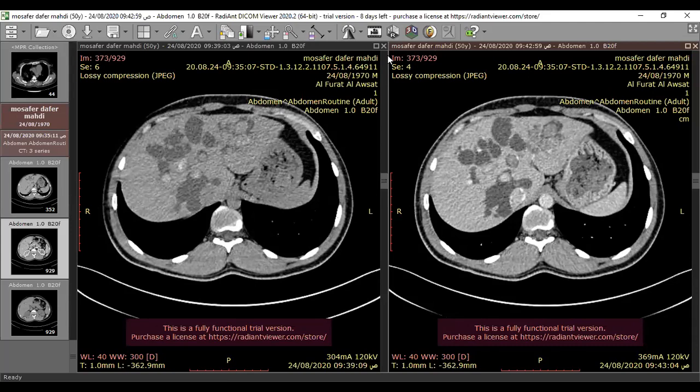Complications include cholangitis with wall thickening. On ultrasound, the bile may appear turbid with increased echogenicity, indicating biliary infection.